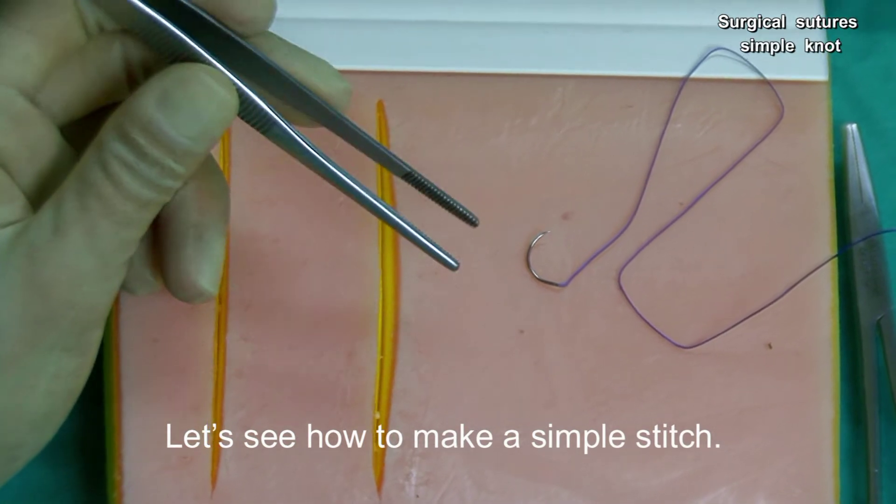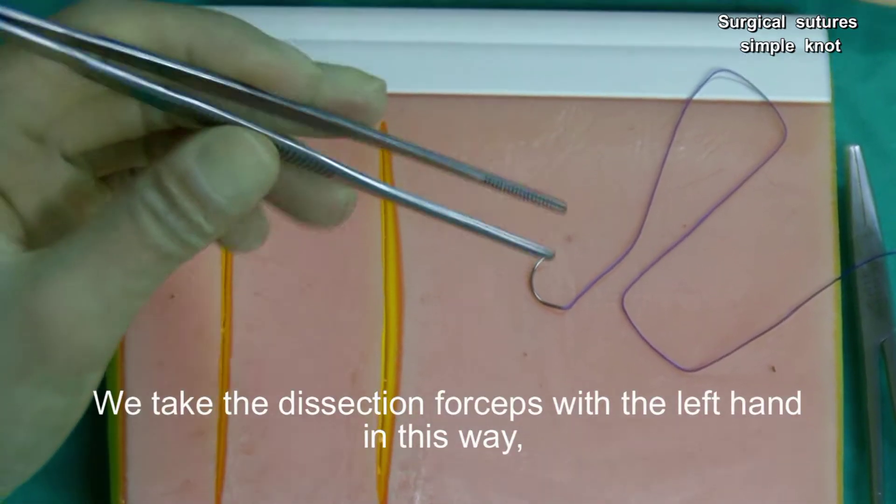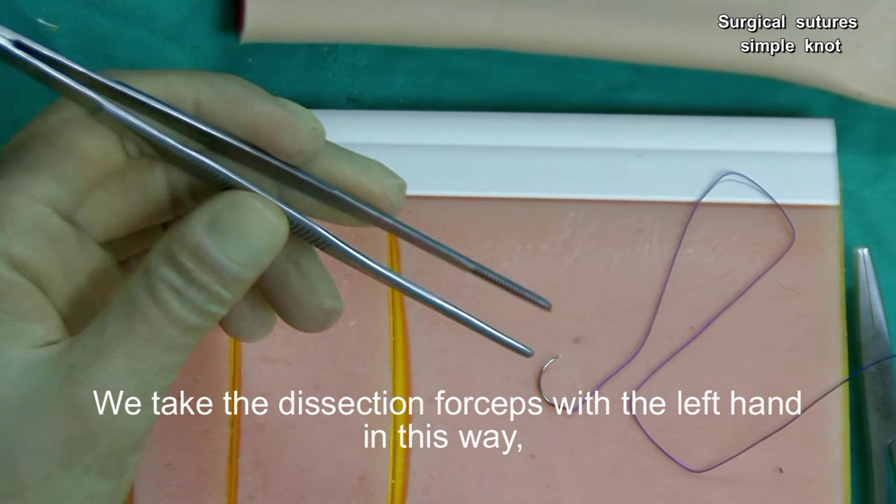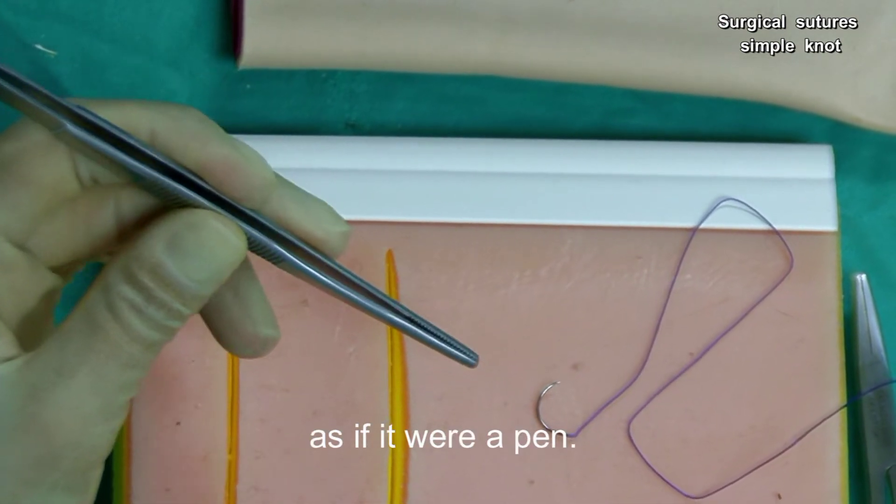Let's see how to make a simple stitch. We take the dissection forceps with the left hand in this way, as if it were a pen.